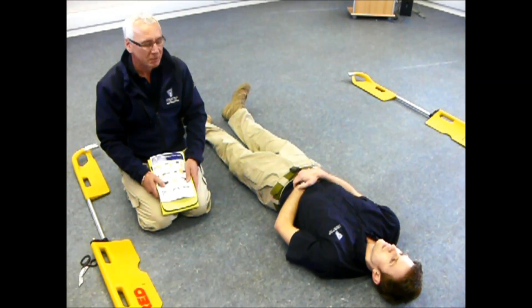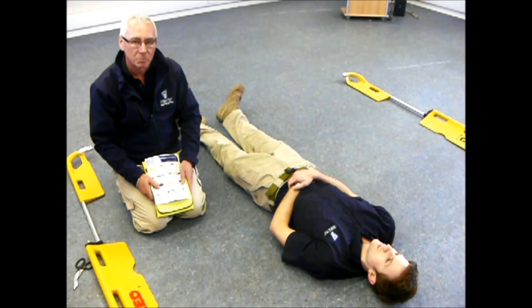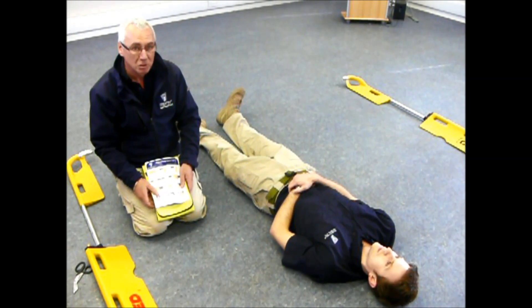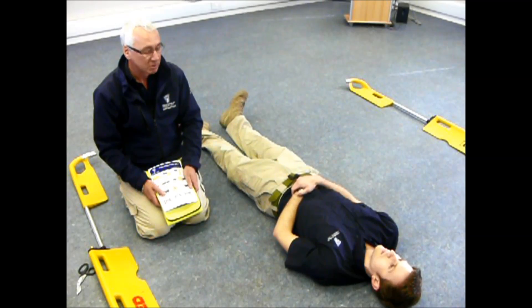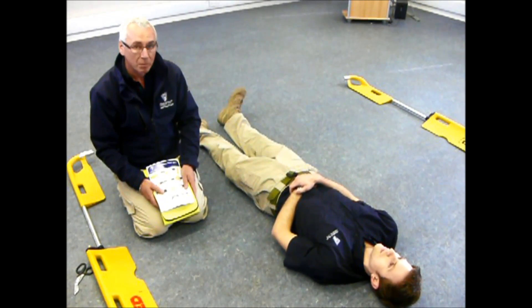This is a demonstration of the Prometheus pelvic splint. When you apply a pelvic splint it's important to follow local protocols. You shouldn't log roll the patient, and JRCALC recommend the use of an orthopedic scoop stretcher, just performing a 15 degree tilt. We're going to utilise that 15 degree tilt to apply the Prometheus pelvic splint, therefore minimising any movement of the patient.